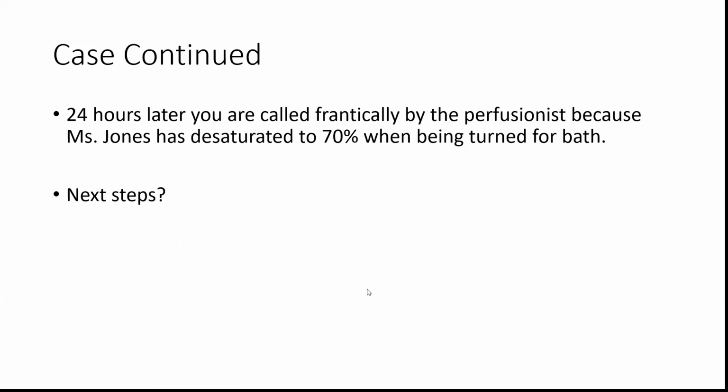So 24 hours later, you're called frantically by the perfusionist because Miss Jones desaturated to 70 while they were giving her a bath. So now what do you do? Second and third years. Okay, so chest X-ray.